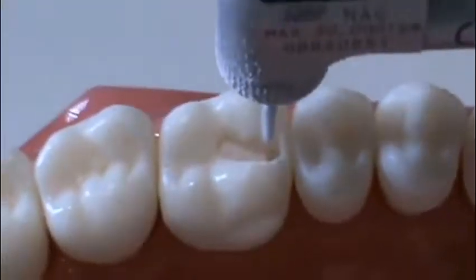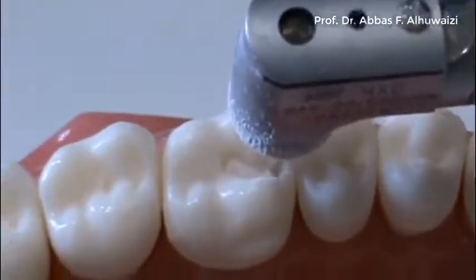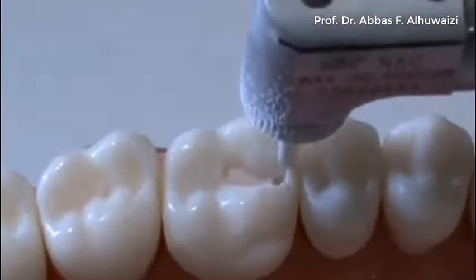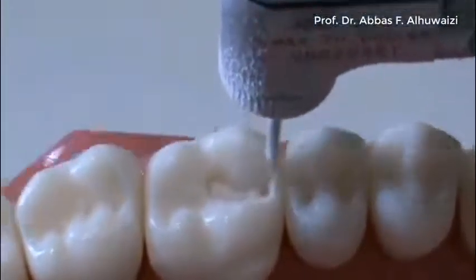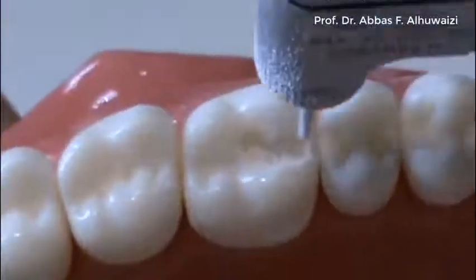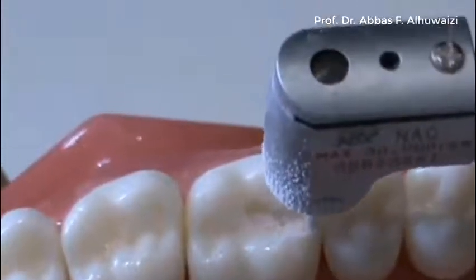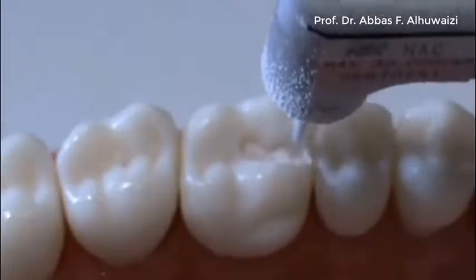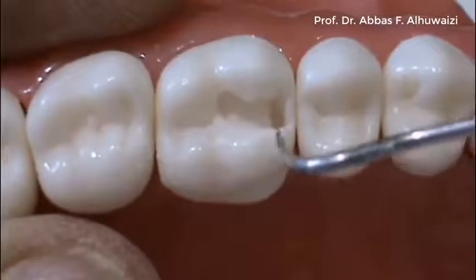Notice the pendulum action of the handpiece. Step 3. Thin the wall separating the box from the adjacent tooth. The advantage of leaving this part of the tooth is to prevent hitting the adjacent tooth during cutting.